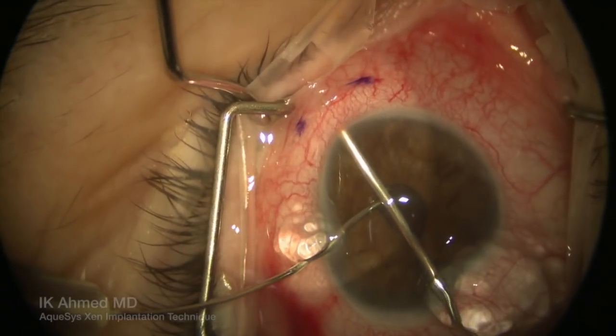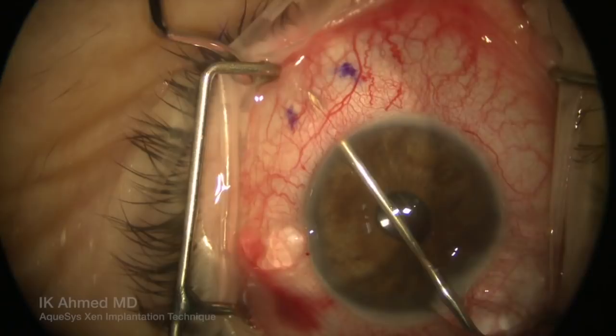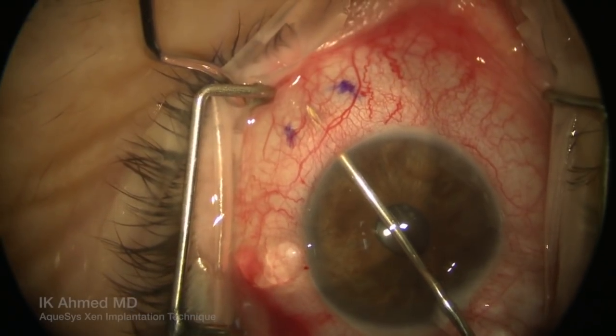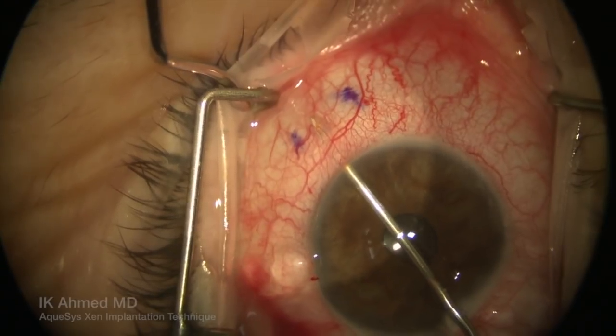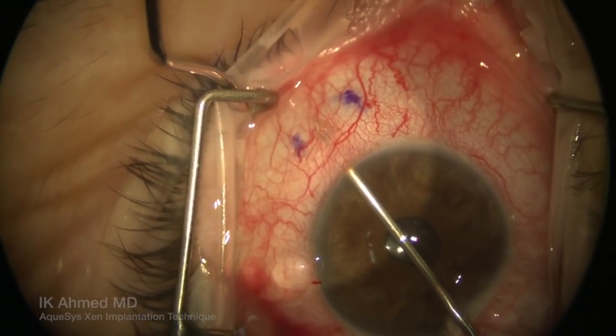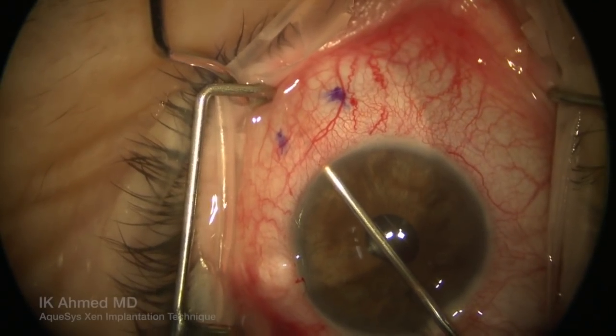Having the initial corneal incision and the angle of approach has helped us to ensure this position. Once the needle is entered into the subconjunctival space, the device is then implanted. First, the device comes forward and the needle retracts back into the hub of the cannula.